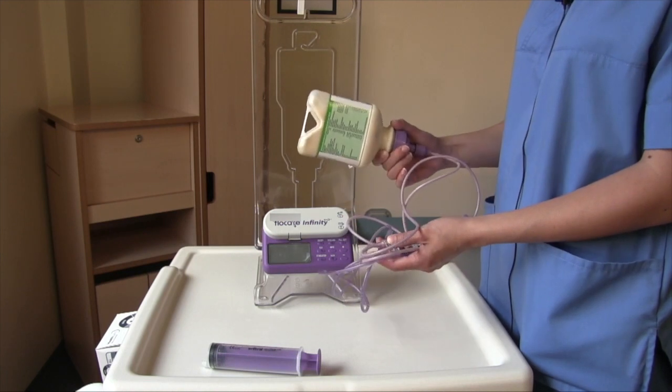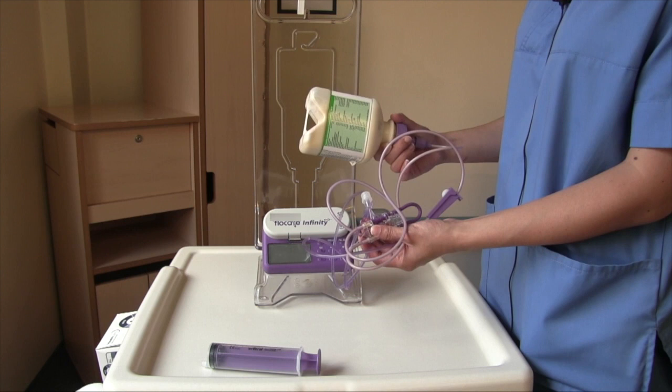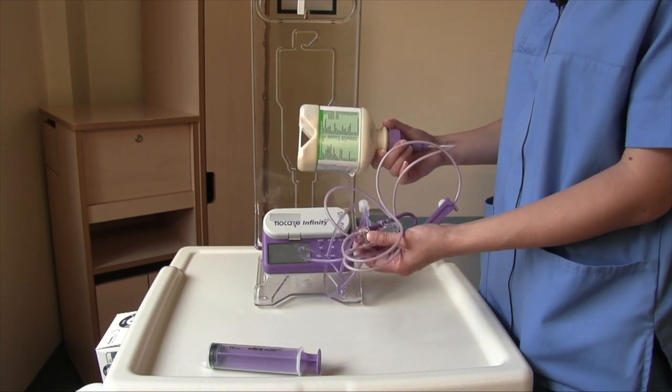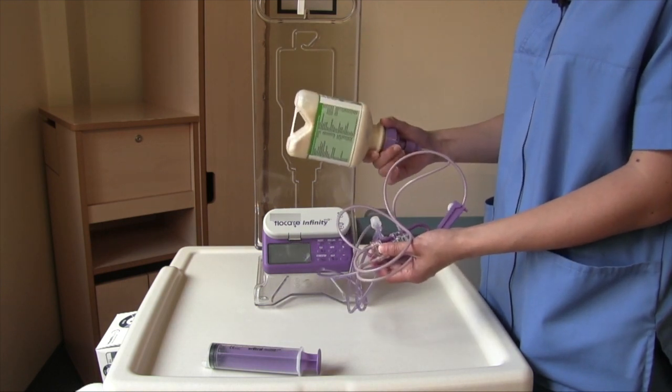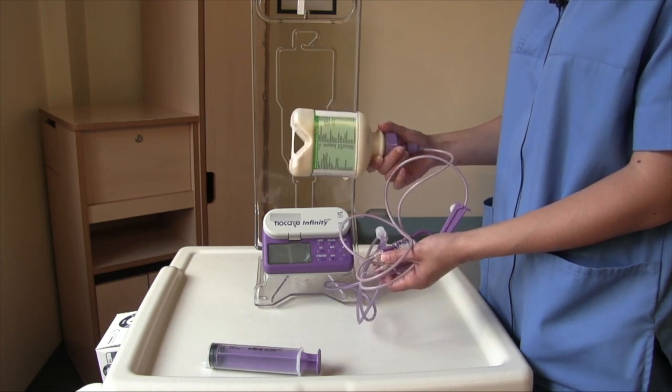Once your feed is done and you've disconnected the giving set from your pump, you will throw away both the feed and the giving set. Once the feed is opened, it's only good for 24 hours, so you'll need to throw the feed away daily.